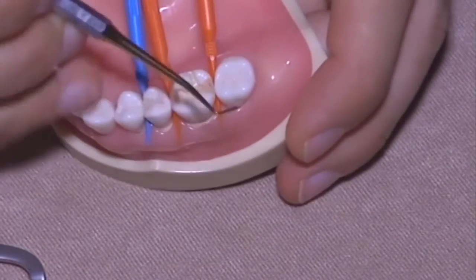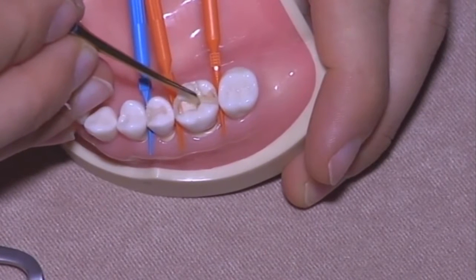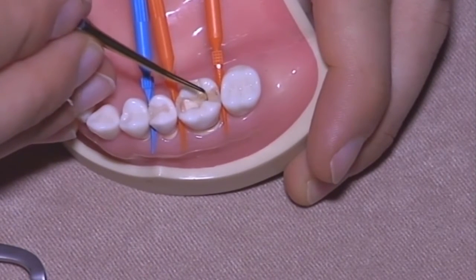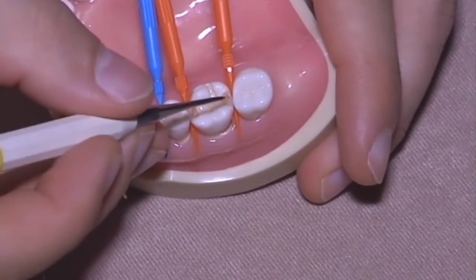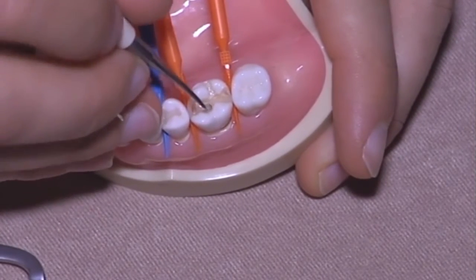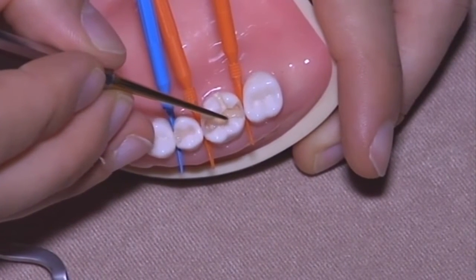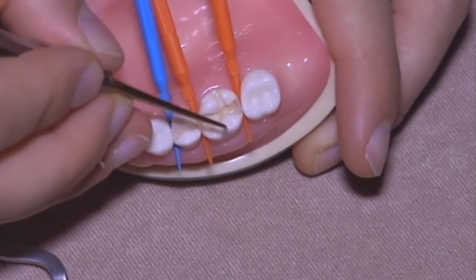If you want to layer the two colors, you need to remember that you need to leave space for the enamel over the dentin, and thus you adapt it, and then with round shaped instruments you just have to push the composite a little bit downwards in order to free the margin.